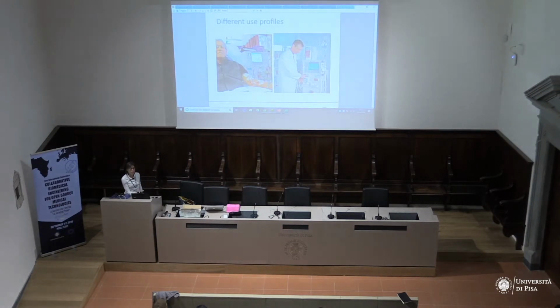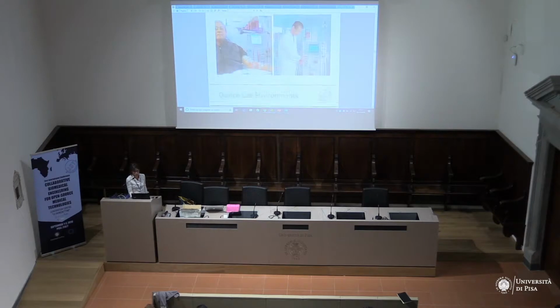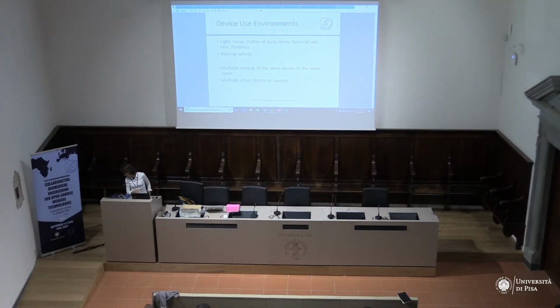Let's go on. This is the same machine with two different users. This gentleman here really wants to know, number one, how long is this going to take today? Number two, please don't make it yell and blink and sound alarms every 2 minutes, because I'm trying to sleep. And this other gentleman here, instead, needs a lot of information from the machine. And he needs to be told if there's something wrong with the patient, okay? So, different user profiles for the same moment of use of the machine. Of course, the different user environments, we spoke about this a bit.